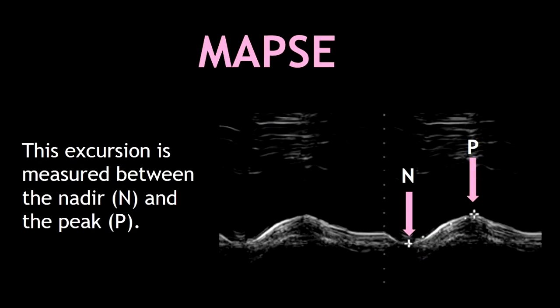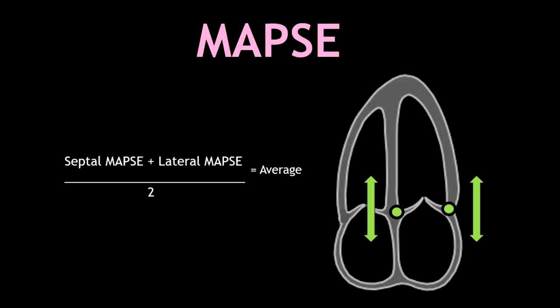This excursion is the distance we measure between the nadir, which is the lowest point, and the peak, which is the highest point. You can measure the excursion from just one annulus only, or you can measure both septal and lateral mitral valve annulus and obtain an average.